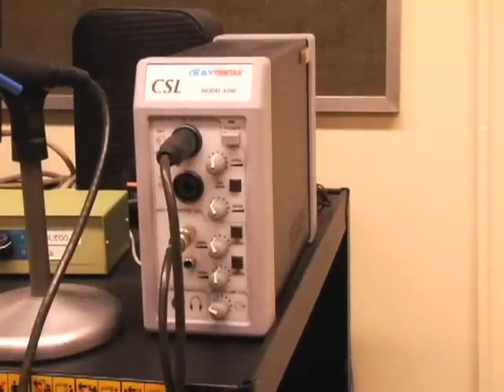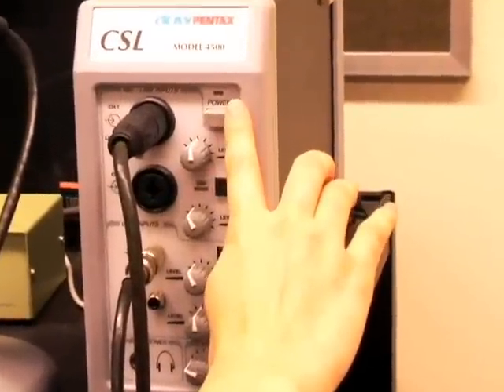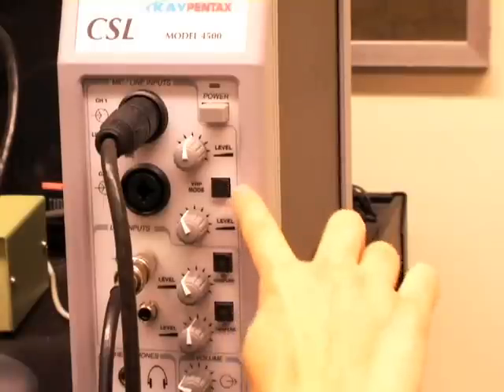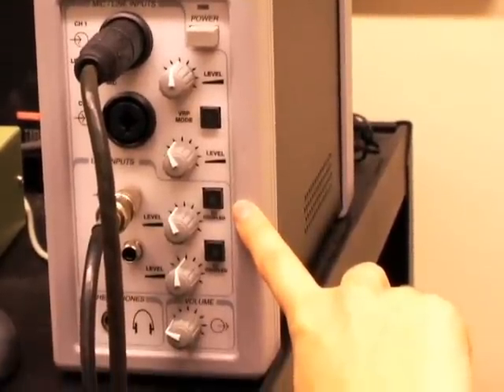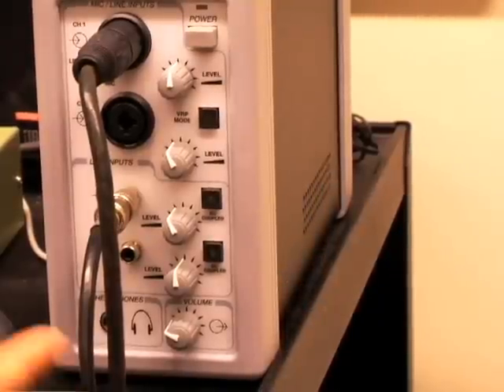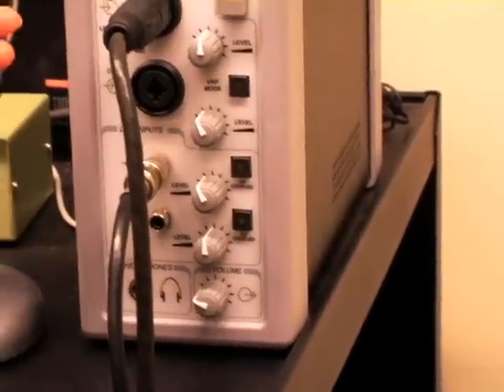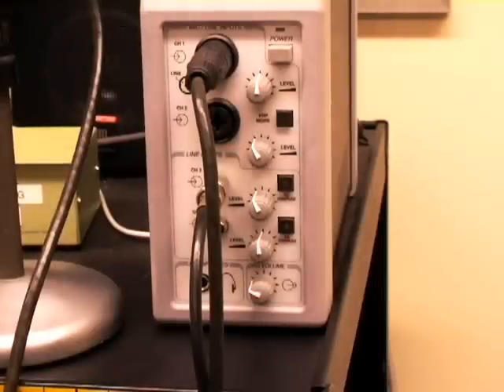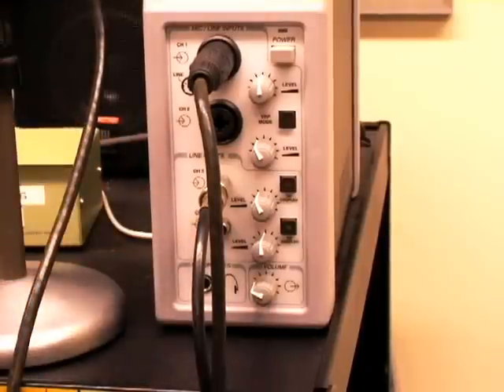Now we are going to show you the parts for the CSL model 4500. Starting at the top: the medical grade power supply. Next we have the calibrated input for real world amplitude measures. Next we have the DC coupling for low frequency signals — CSL 4500 only — and the bottom dial is the convenient control of input and output levels. Over on the left we have the XLR microphone inputs for superior noise suppression. The next plug is the output to a professional level speaker for high fidelity playback, and the last plug is the stereo headphone output.